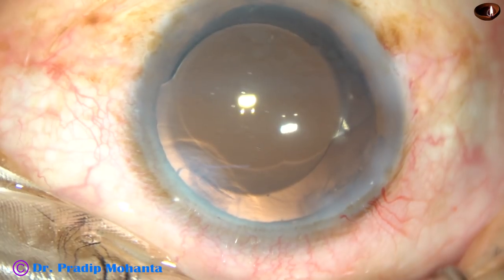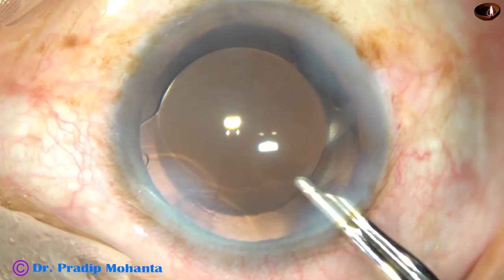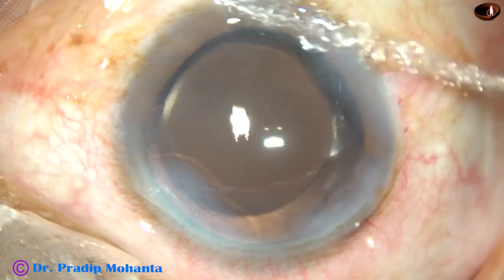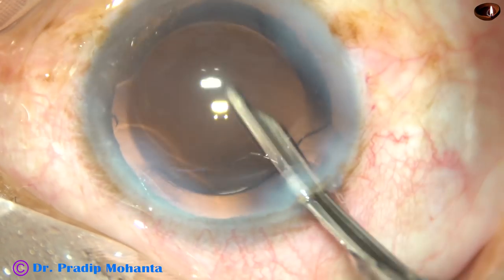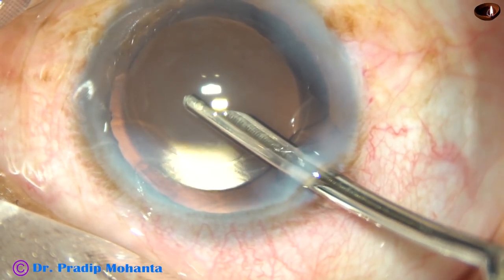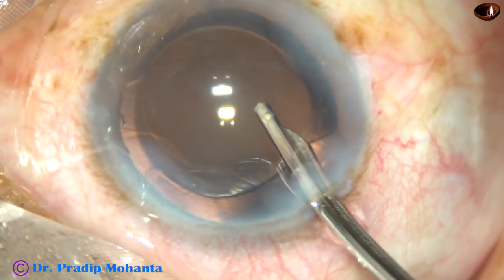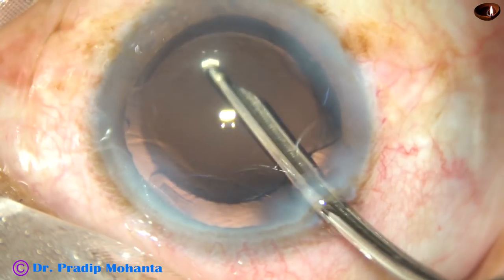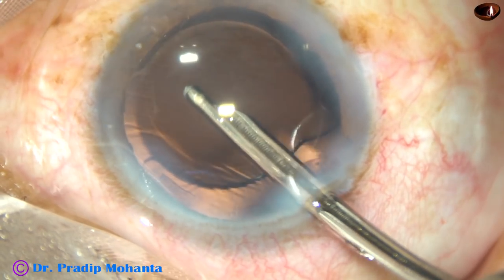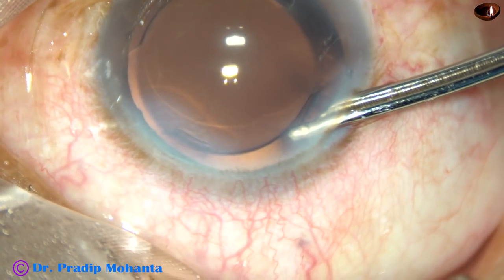And now this is the final lavage of the anterior chamber. Whatever visco sticks to the corneal endothelium comes out at this time, because the fluid jet is directed towards the corneal endothelium very gently. The anterior chamber is formed very nicely. The intraocular pressure should be on the higher side, and the case is concluded.